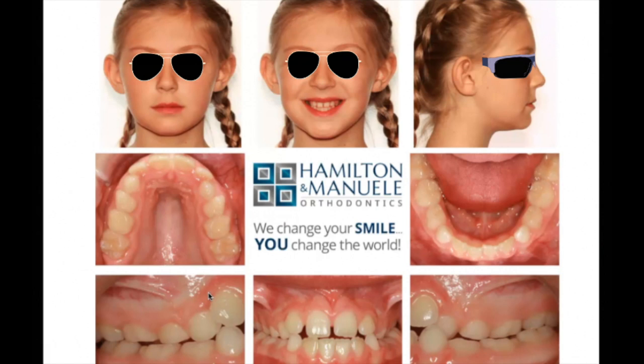You're going to see maxillary protraction. You want to have them wear that at least every night. The more hours they get with it, the more response that you would expect to see. And you're going to have a trade-off between skeletal protraction and maxillary protraction of the dentition itself. Although with good rooted primary teeth, the maxillary protraction of the dentition is typically pretty small.